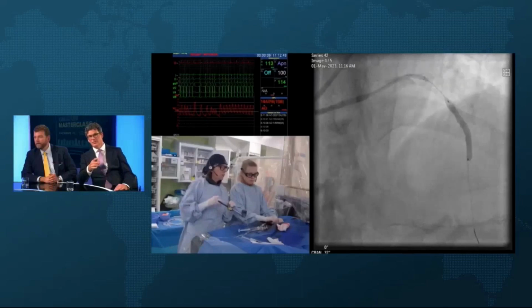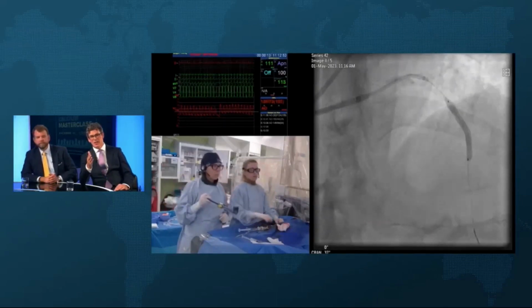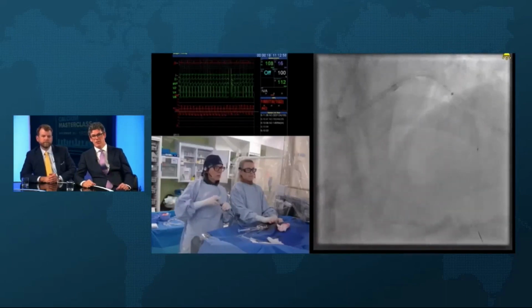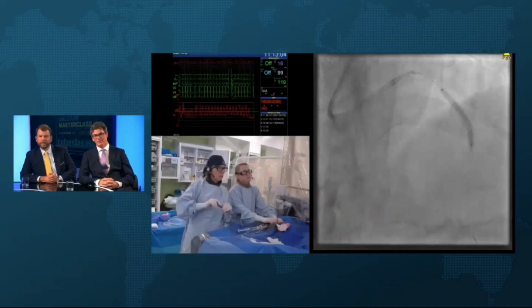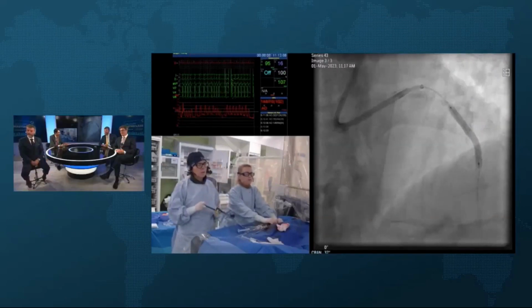Yeah, you just push it along. Here is a lovely example of the expansion of the stent. It's long, isn't it? It was almost completely even along the length. There was a little bit of restriction at that nodular section. Just a little bit. And even just seeing how the stent delivered. I mean, think about what that vessel looked like before we got started. Remember, being able to deliver stents like that is no atherectomy.